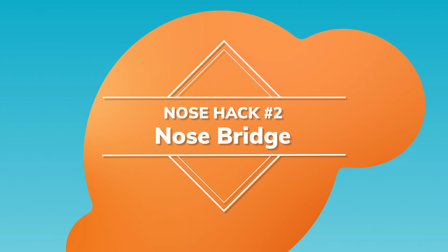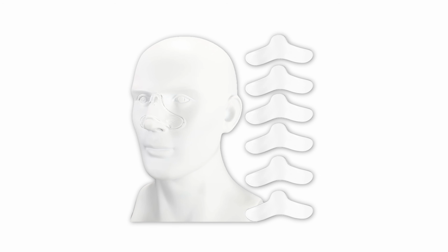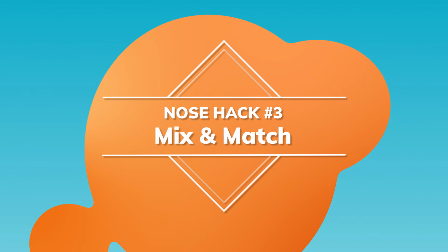Hack 2. If you do really need or want a mask that sits across the bridge of your nose, then you can get a gel nose bridge pad that can help smooth out the contours and reduce bruising and digging in from hard mask frames. Hack 3.